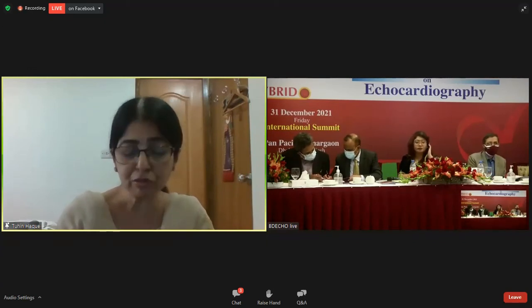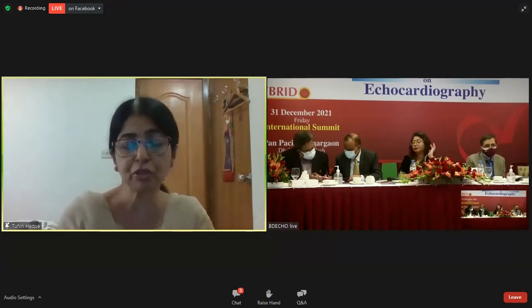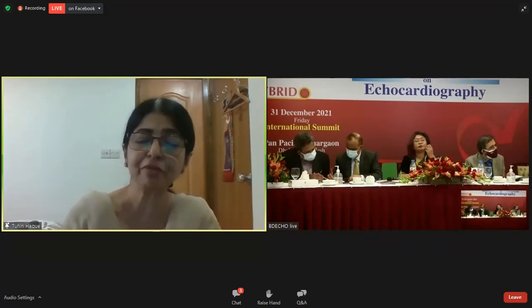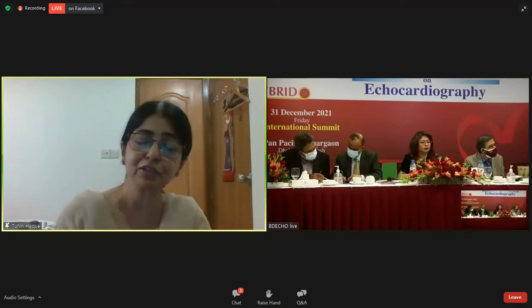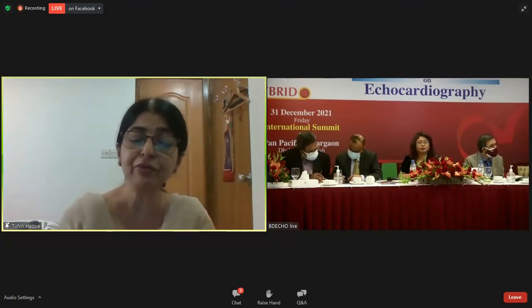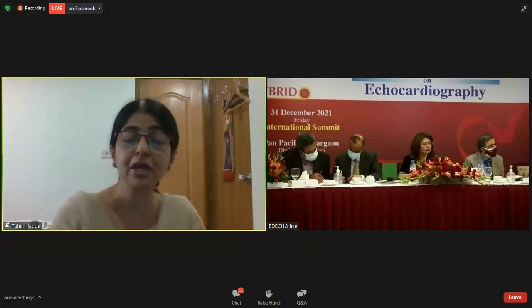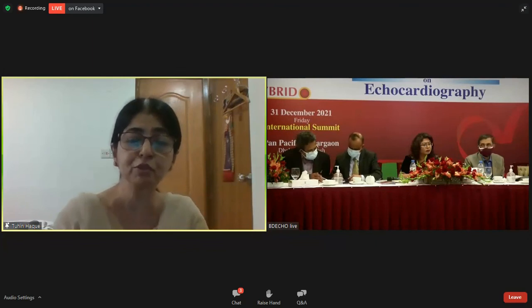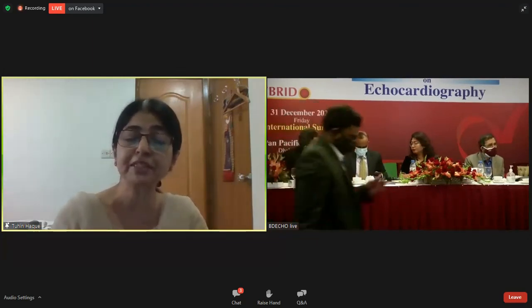And I want to ask Dr. Santosh Kumar Sinha to look carefully. I think there was also a supravalvular membrane. When he was showing the four-chamber view, I think something was moving near the annulus, and the turbulence was from there. So it is common that parachute mitral valve and supravalvular mitral membrane are both present in the same case.